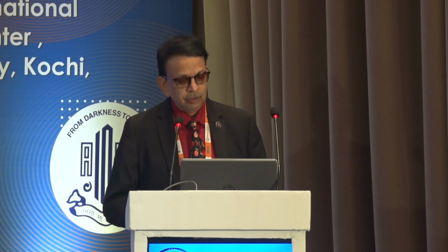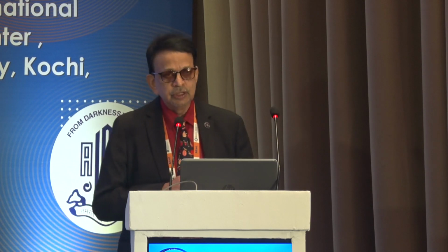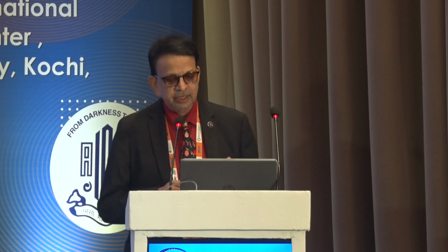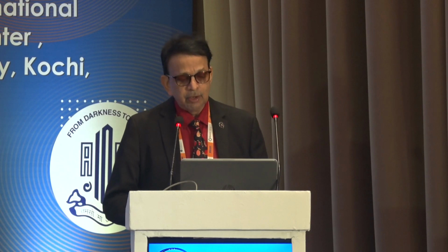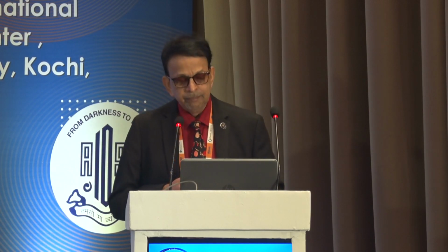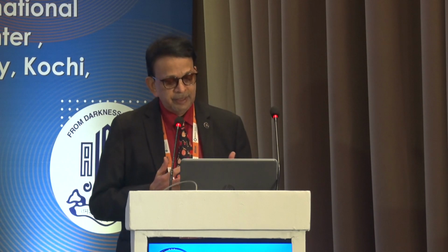So if you do the conventional divide and conquer and stop and chop, you can end up using a lot of phaco energy, and you can have a corneal burn. And you know the consequences of a corneal burn, like irregular astigmatism, wound infection, intraocular infection, inflammation, wound gaping, and all these problems occur. You can have a corneal edema like this, for example, after a manual phaco in a brown cataract if you don't follow the proper parameters and protocols.